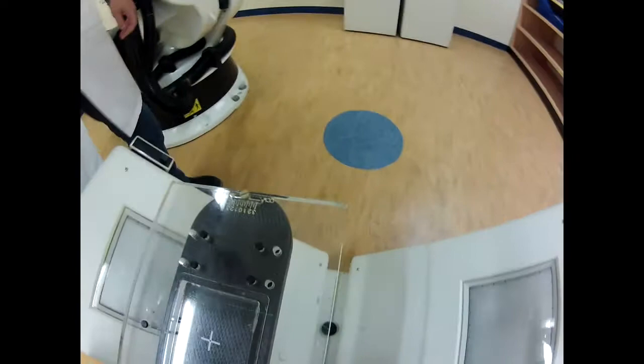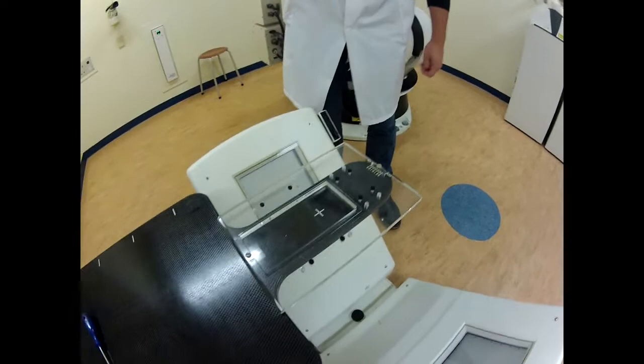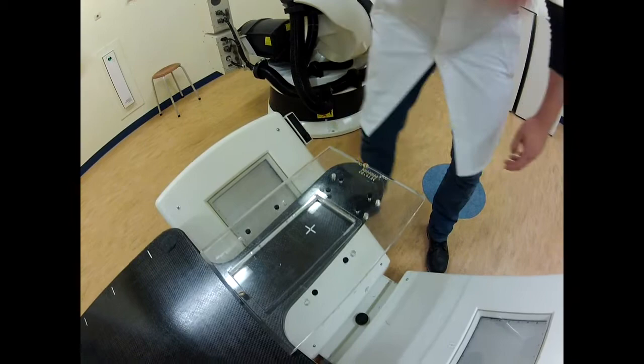When you're making x-ray images during treatment and you notice during the matching that there's clockwise or counterclockwise rotations, you can then untighten the screw and turn the base plate as far as you like and then tighten it again to resolve the clockwise, counterclockwise rotations.